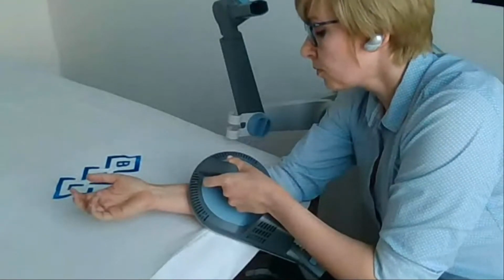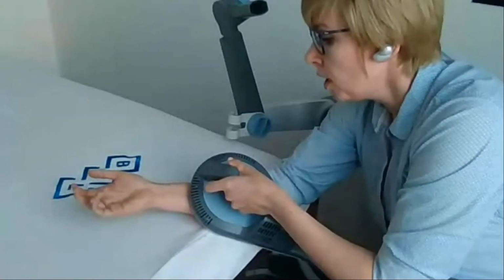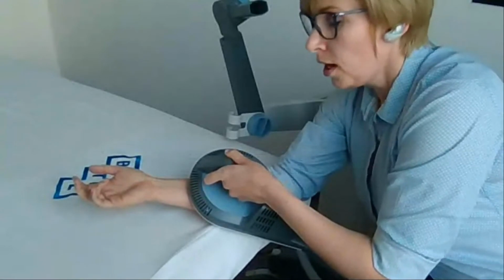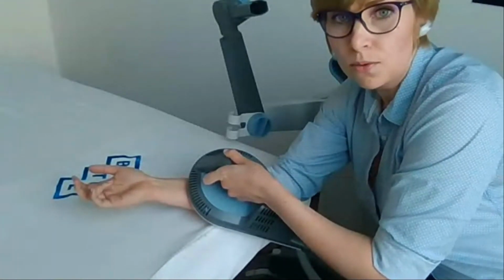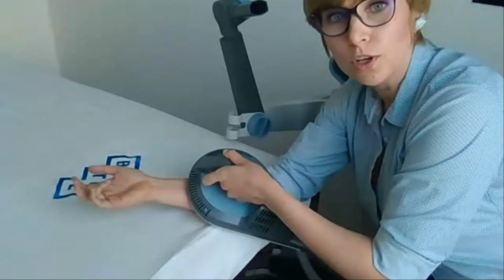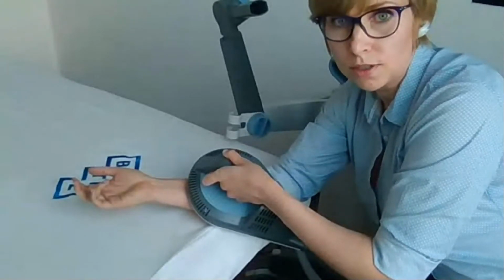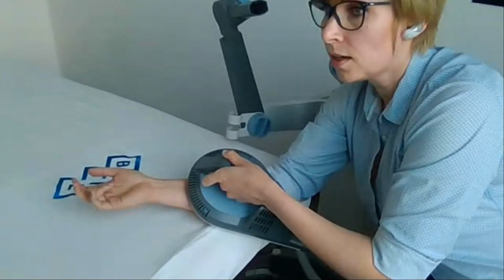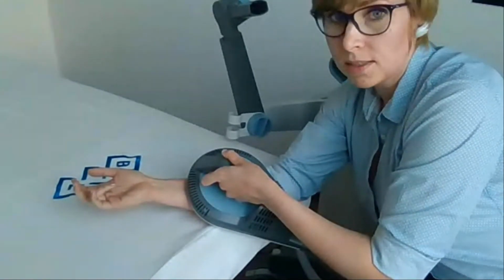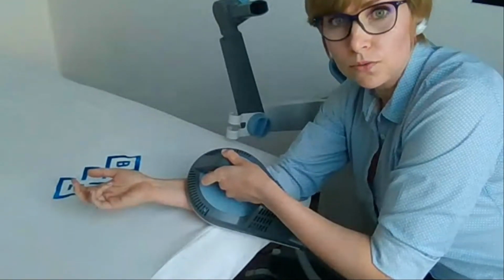So you should be secure in every case, as I will show you later. You can hear now how the magnetic field works. You can see how the magnetic field works, and I am actually feeling the tingling, the very small vibration. I don't want to upload big intensity in this case, because if I would, it would be uncomfortable for me.